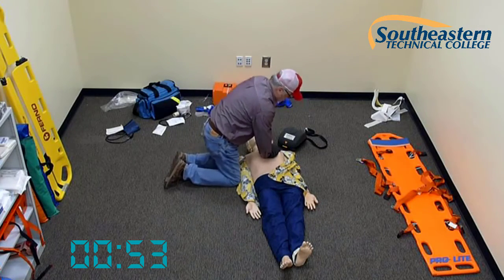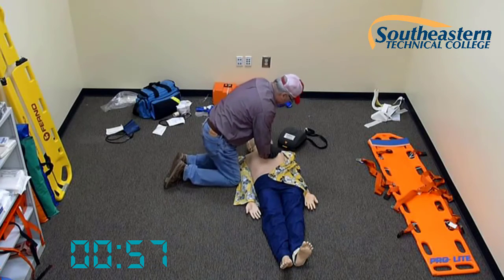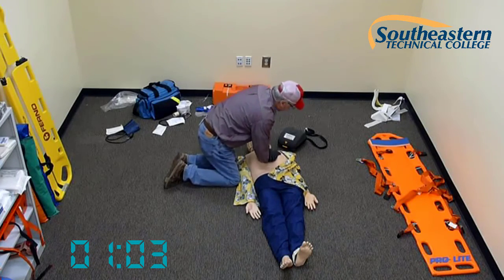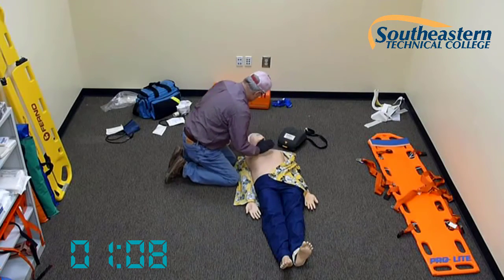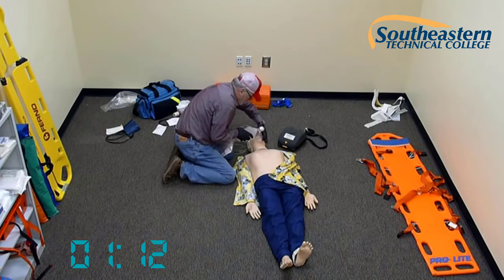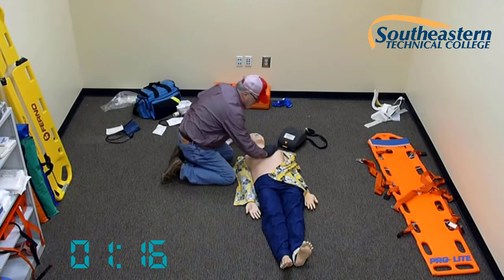1, 2, 3, 4, 5, 6, 7, 8, 9, 10, 11, 12, 13, 14, 15, 16, 17, 18, 19, 20, 21, 22, 23, 24, 26, 27, 28, 29, 30. Making sure that we get good chest rise.